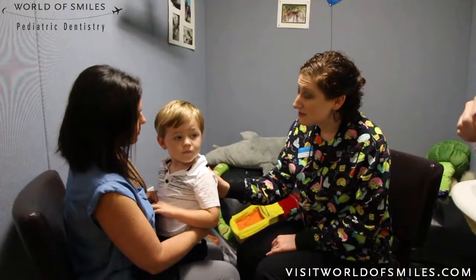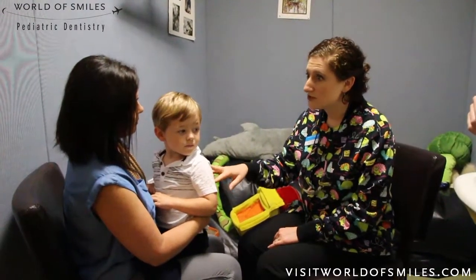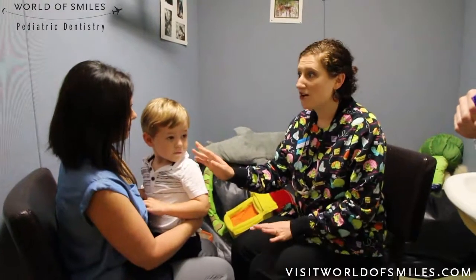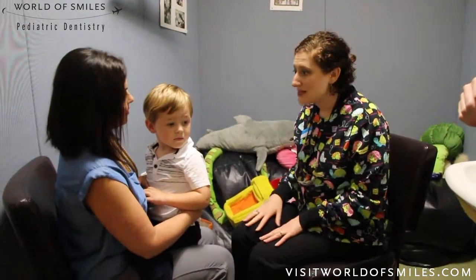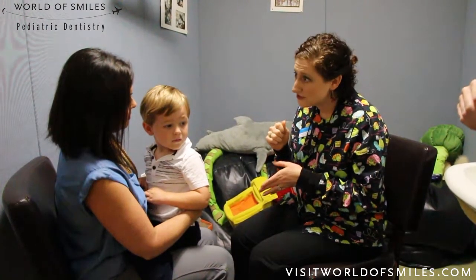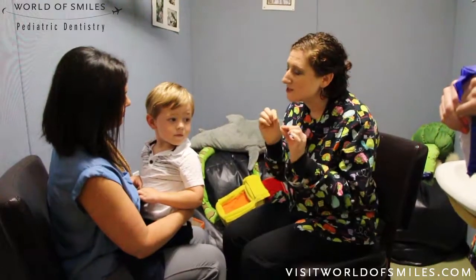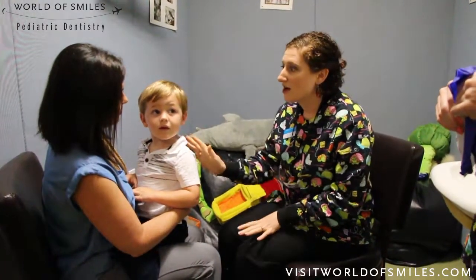We're ready to apply the silver diamine fluoride. I'll tell you quickly what we're going to do: as soon as we're gloved up and ready, I'll have you lean him back in my lap. I'm going to dry the teeth and apply it to the front teeth first, then dry the back teeth and use our special floss to put it in the back teeth.